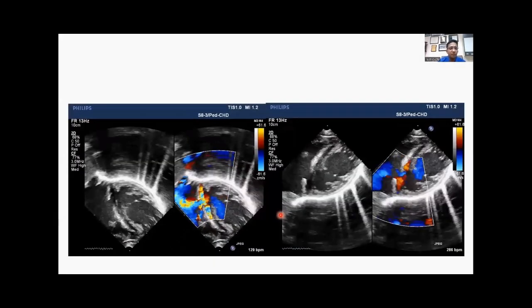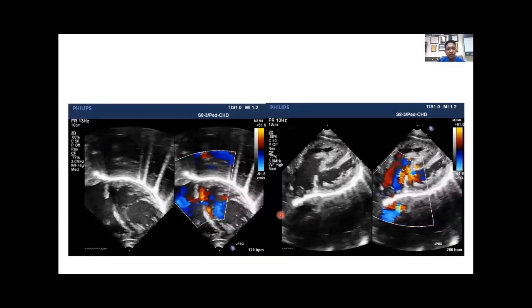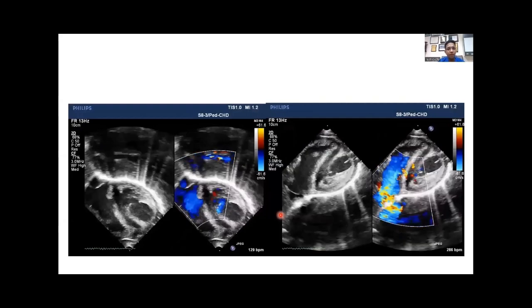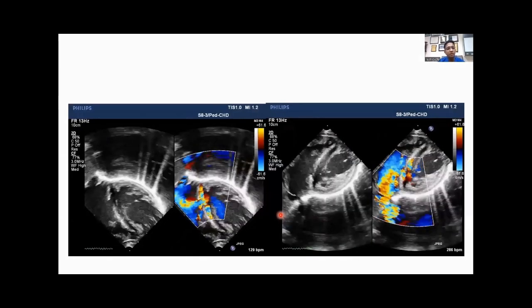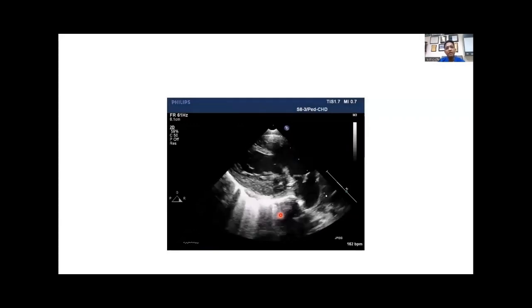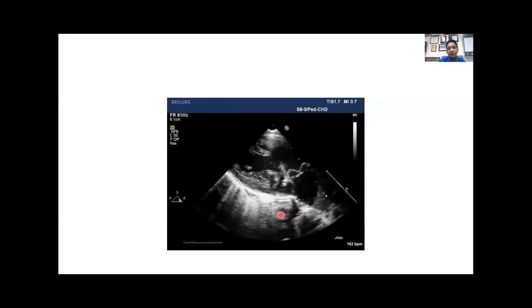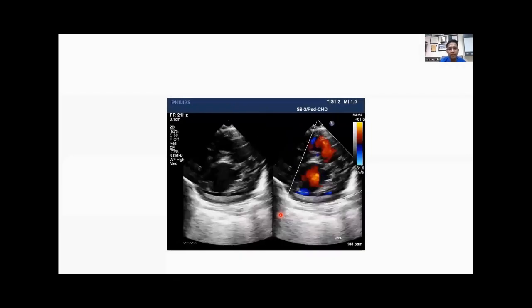In an apical four-chamber view, the anterior muscular VSDs are seen with anterior sweep, when the aorta has been closed and the pulmonary valve is opened. In parasternal long axis view, again, very much anterior sweep is required to image these anterior muscular VSDs.